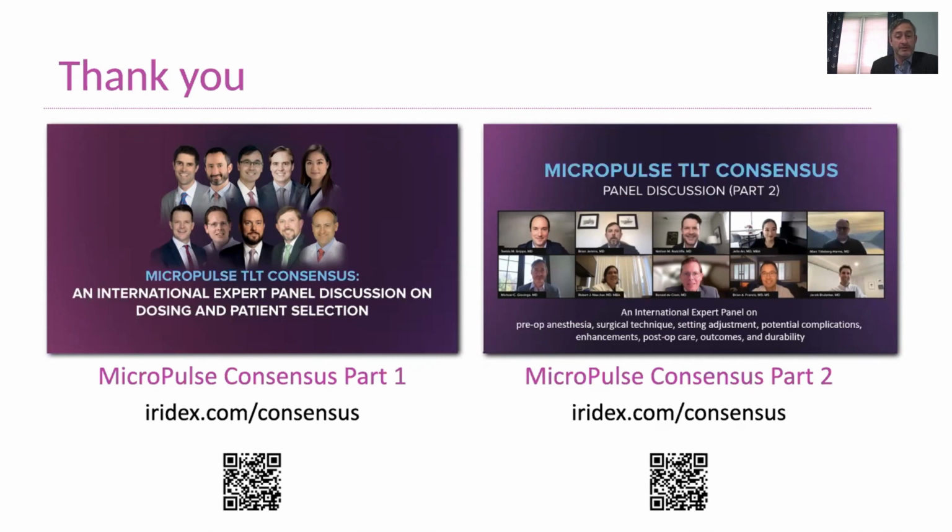The other thing is, just for the people watching, that this isn't a magic bullet. There are no magic bullets in all of glaucoma. Otherwise, we would be just saying there's one procedure that everybody should have. It's very good pre-surgically. It's a very good adjunct after surgery. Most of the things that we do take up maybe 20% or 30% of the patient's pressure needs. So it's just an excellent tool to have in all different types of glaucoma, all different surgical states. And I think it's absolutely necessary in today's glaucoma world.